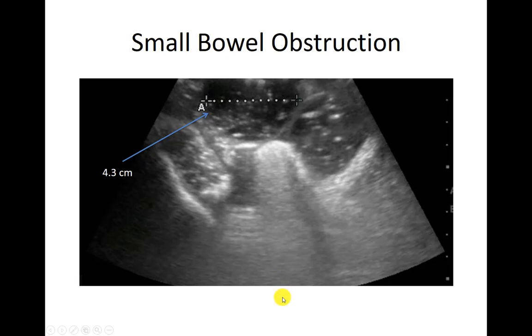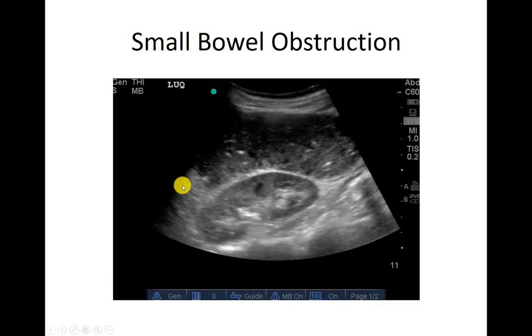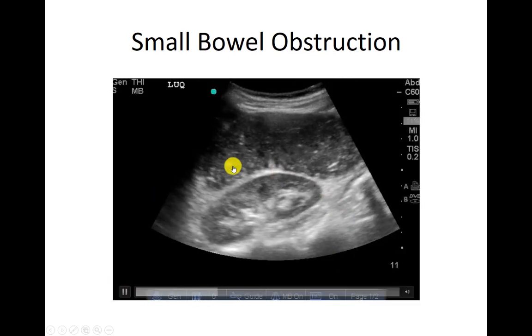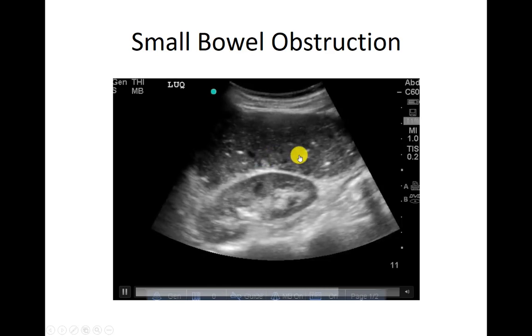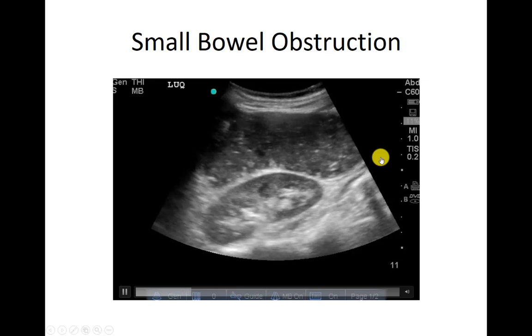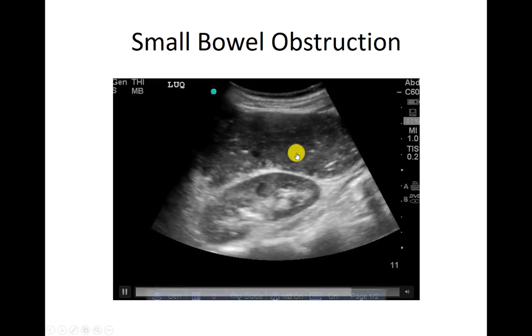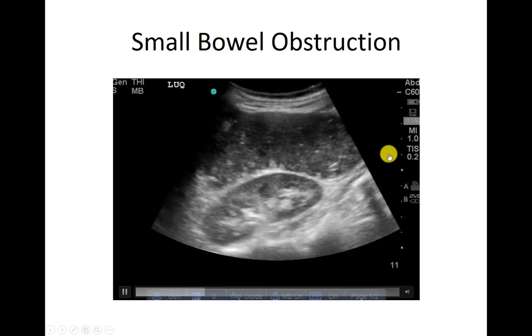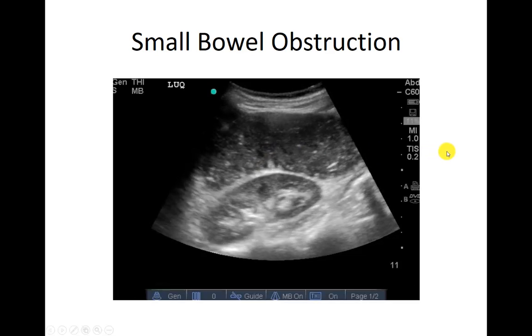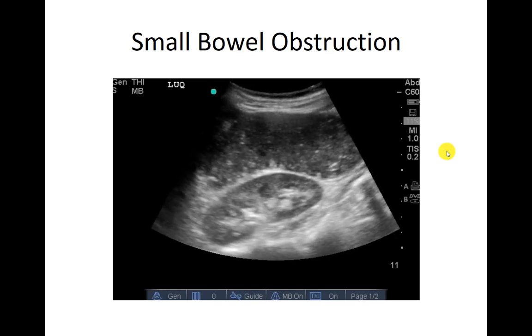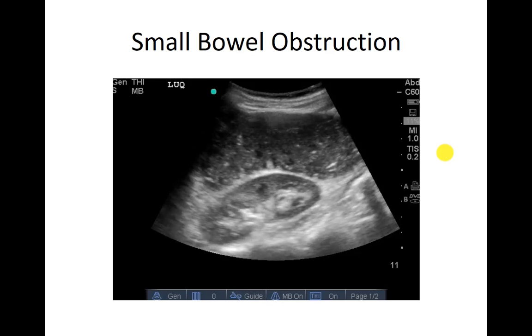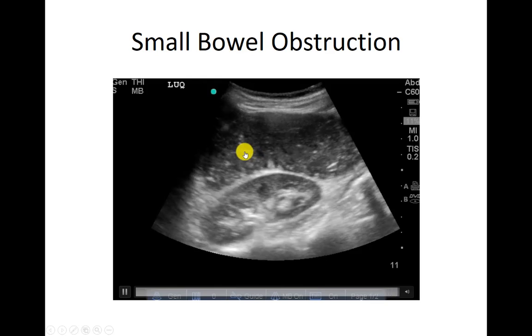Here's an example: a loop of bowel with a starry sky appearance from little flecks of air. We measure it — it's greater than 2.5 centimeters, that's too big. In another example, we watch those stars and they're not actually going anywhere. When you watch normal bowel, these little bits of gas should be moseying their way through. When you press on them they squish away and move. Here, when they're not moving — just going half a centimeter this way and back — they're not really going anywhere due to blockage.